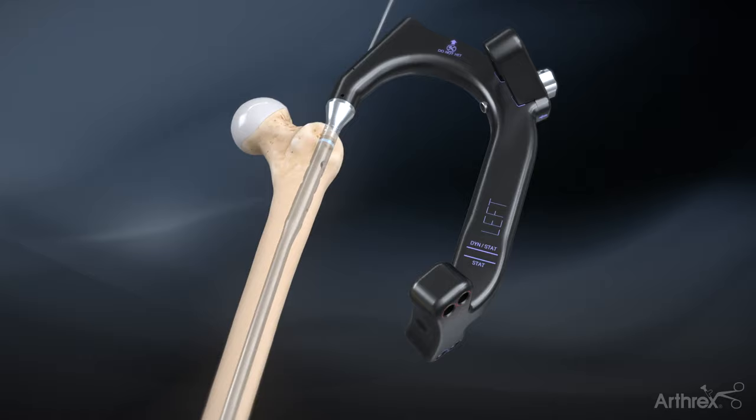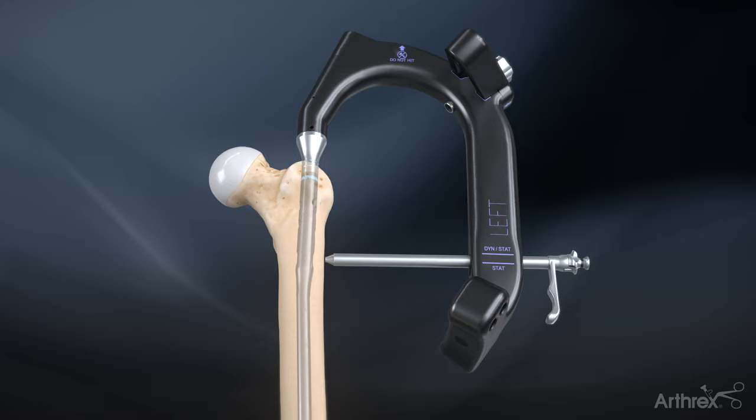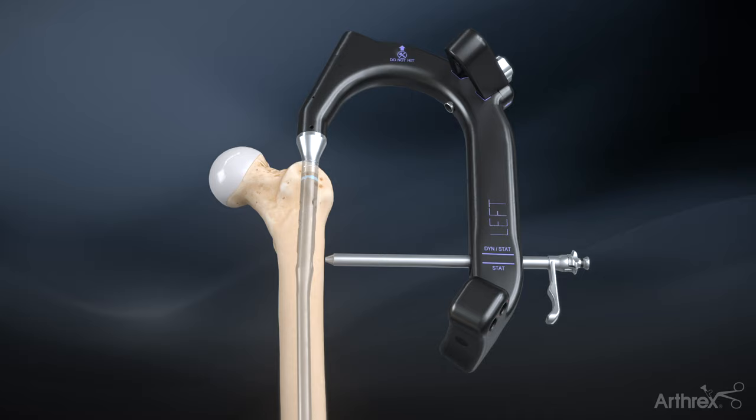Remove the ball nose guide wire and slide the screw sheath, 4 mm drill guide and 4 mm obturator assembly through the appropriate transverse hole in the targeting guide until it contacts with the lateral cortex of the bone.